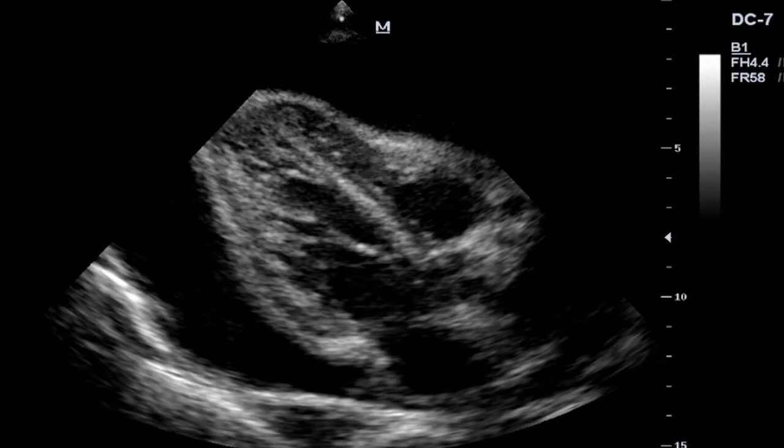is called the pericardium. So you can actually see here that there is free fluid. This region that we have here is what we call the pericardial space or the cavity. So the pericardial cavity that we have here. So this is our heart. You can actually see there's a disfigurement or disorientation of the normal architecture of the heart here. So here the heart is actually compressed by this free fluid.